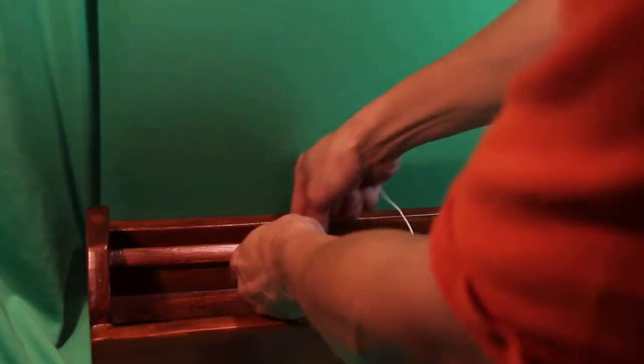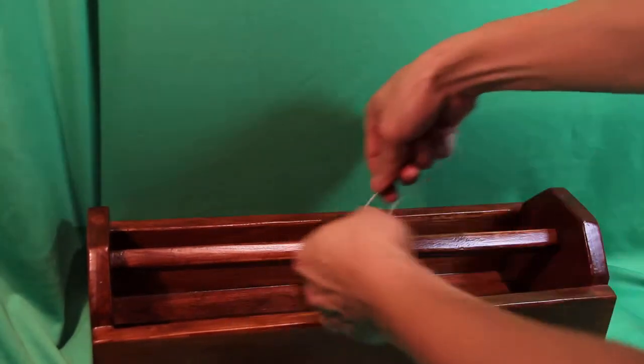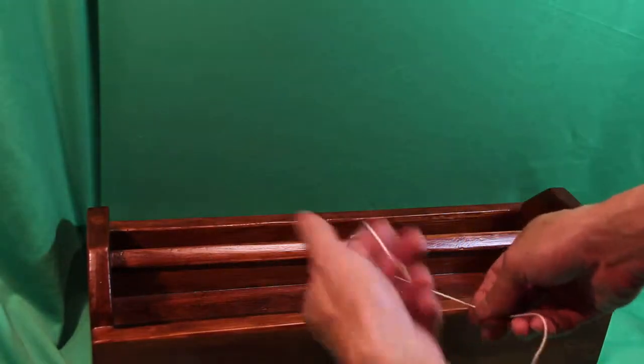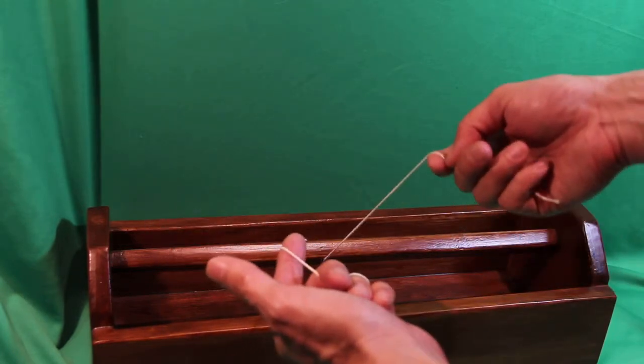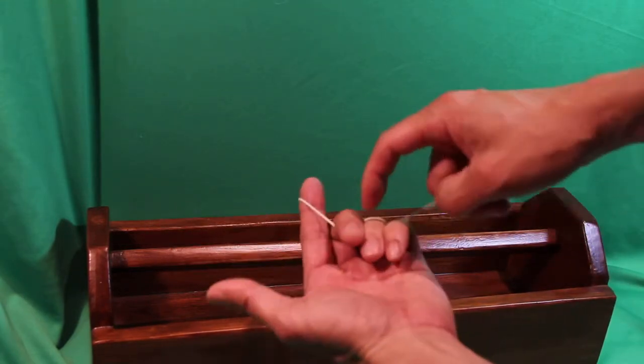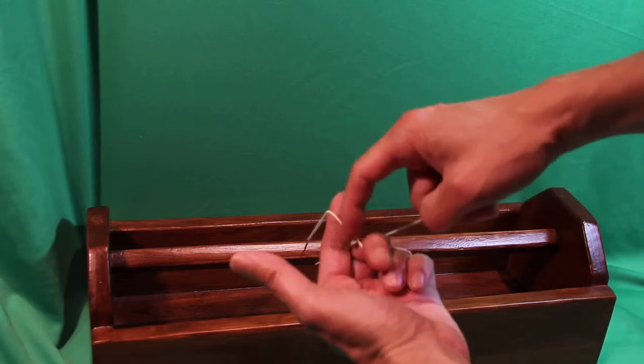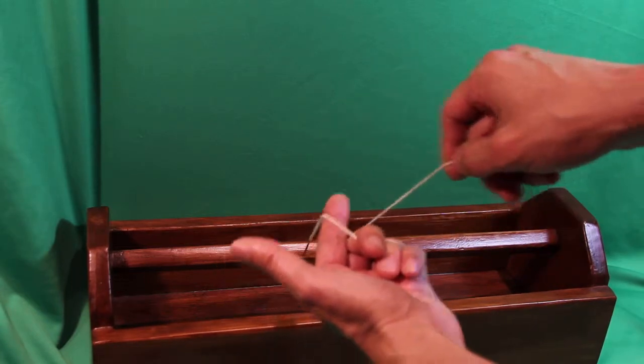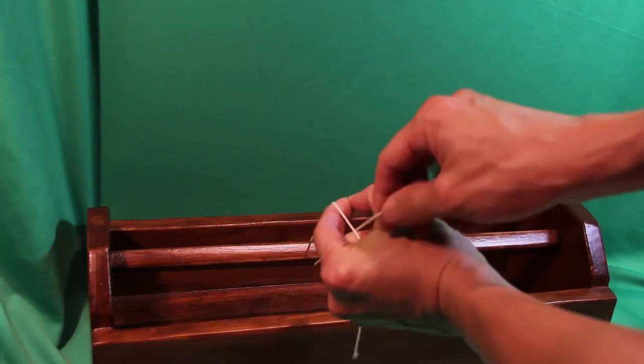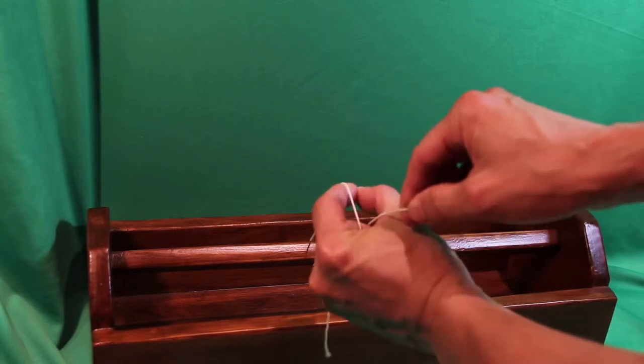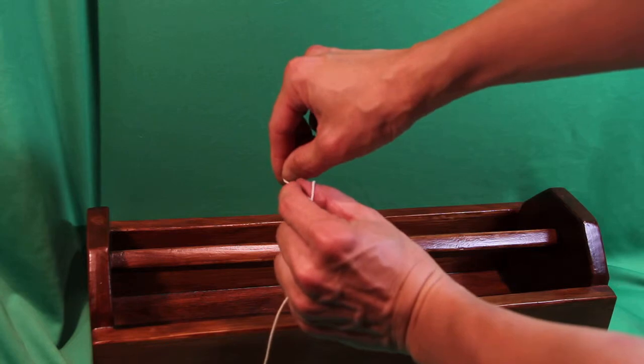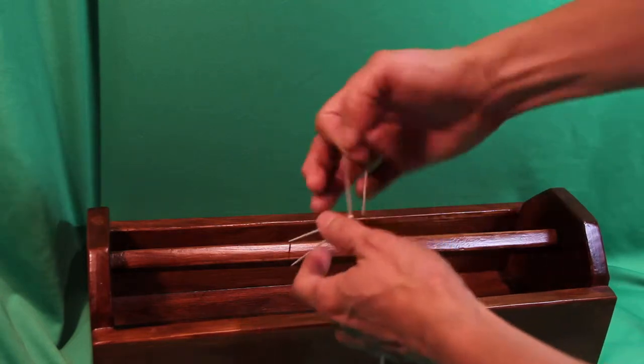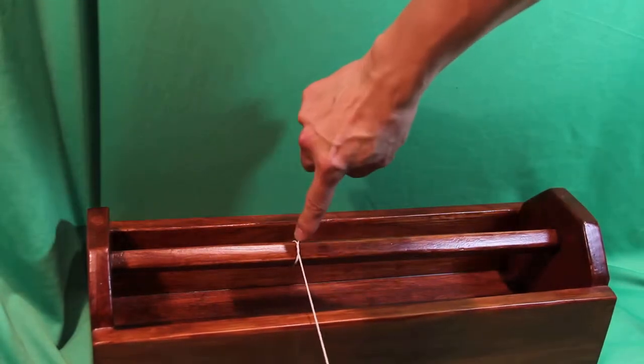Let's repeat that. So you cross. Left hand on one strand up. Right hand the other strand down. Anchor your end of your suture over your index finger. Cross. Thumb and index finger together. Come under the loop. Pass the strand back through the loop. Nice and flat.